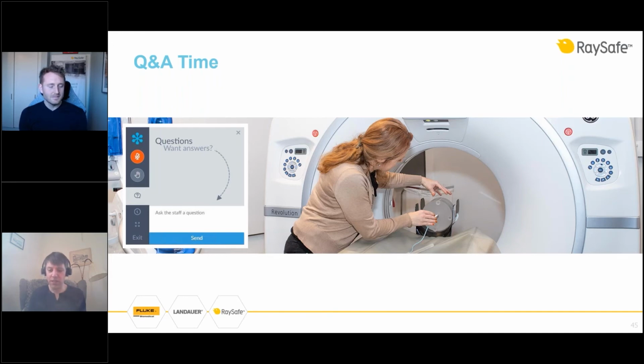You can only do that if you have made a measurement, if you have made an exposure. And then you need to, again, view the measurement on a PC and export to Excel. I think you will also be able to see the pressure and temperature in RaySafe View itself, but I am a little bit hazy on those details. You can for sure see it if you export to Excel.